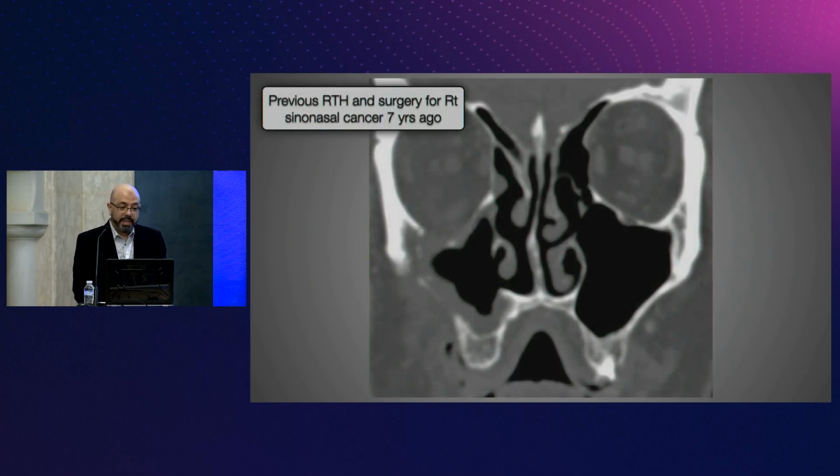Previous radiotherapy and surgery for right sinonasal cancer 7 years ago. We're seeing this now more often because of the better medical and surgical management that we have nowadays. So patients will survive longer. That's why we see ORN more often now.